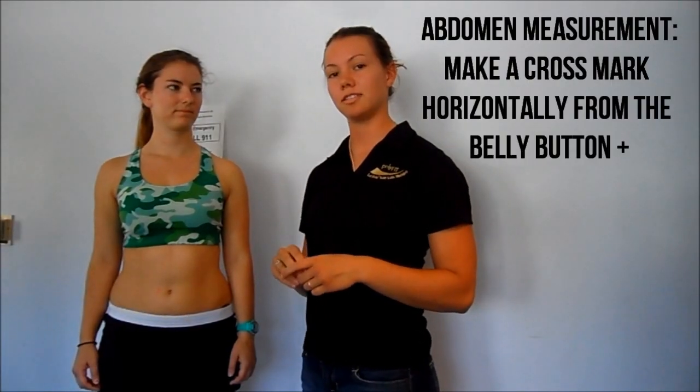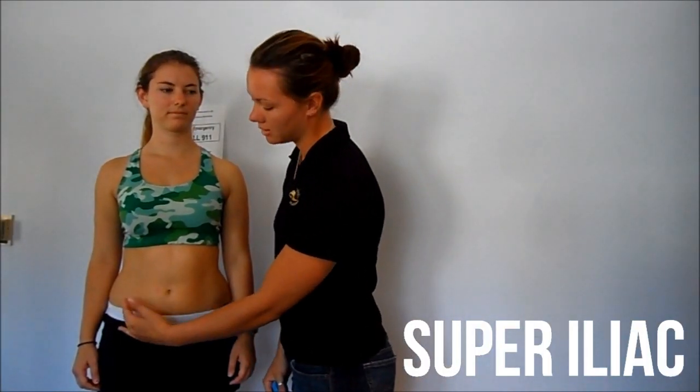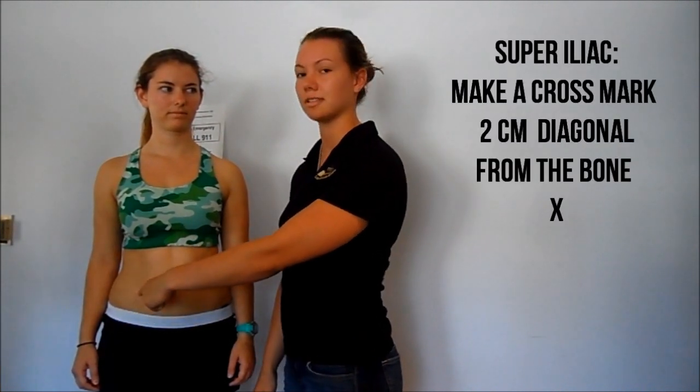The last site of testing is the suprailiac. You'll find the natural line of the iliac bone and go just superior to that and make a line in the direction of the bone, so it's a diagonal test.